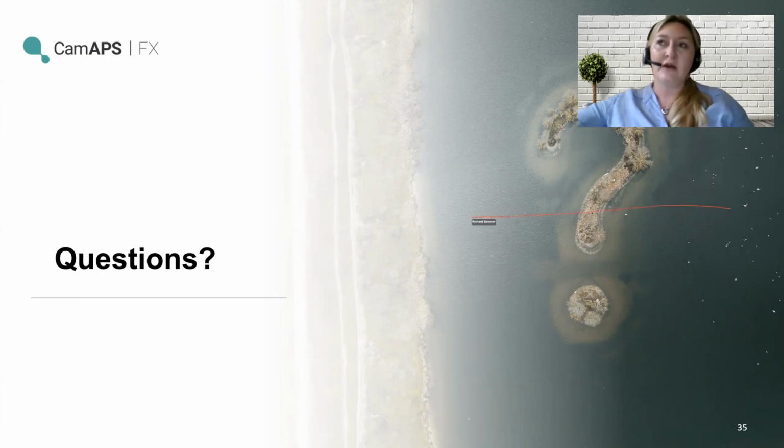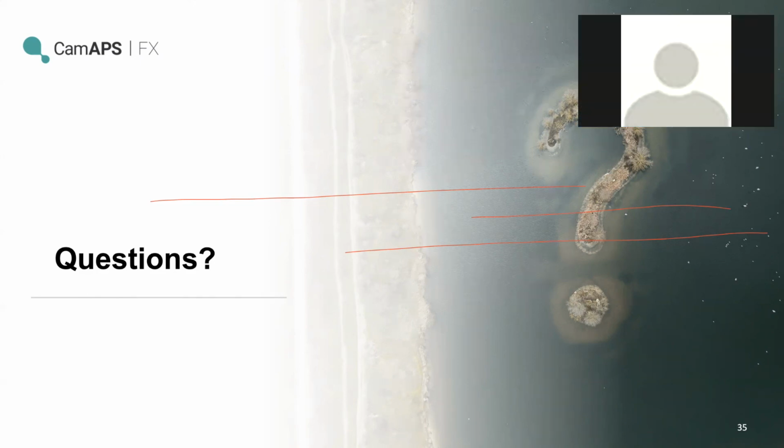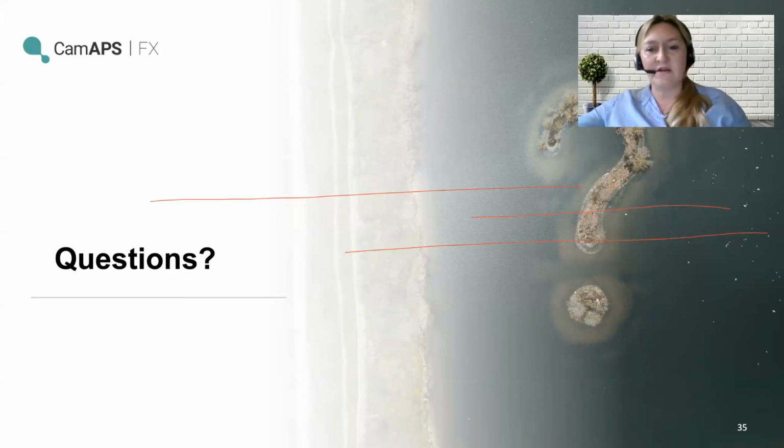But once we got down to aiming for around 8.5 to 9, the time in range was actually pretty decent, up in the 70% quite quickly, even though the target was quite high, and the variability was reduced dramatically. I think that's what made the huge difference. And you can show off, Annika, or I'll show off on your behalf, what's your A1C now?